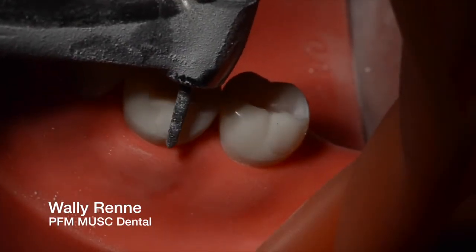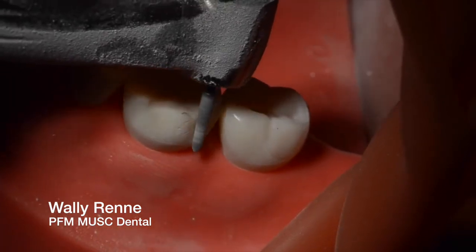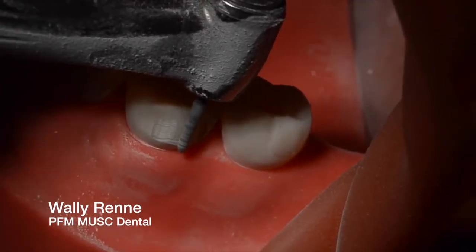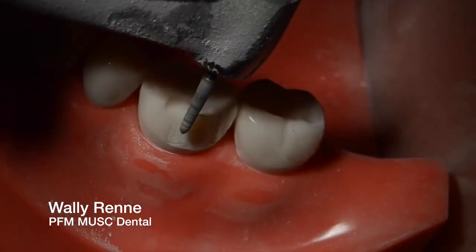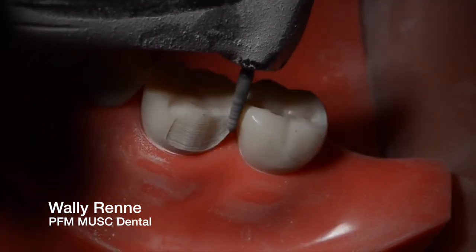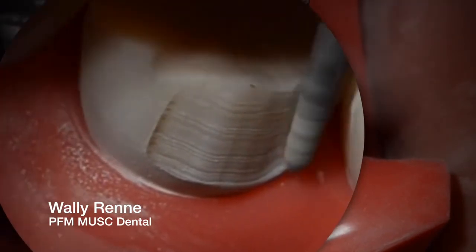Switch to a 878K018 chamfer diamond for a heavy chamfer. I'm not doing depth cuts on the axial walls — I think that's ridiculous. Just go ahead and start focusing on your finish line. By definition, if you hold your bur parallel to the long axis of the tooth and give a one millimeter chamfer, it's almost impossible to under-reduce your axial wall. So I'm just focusing on my finish line here, trying to get a heavy chamfer.